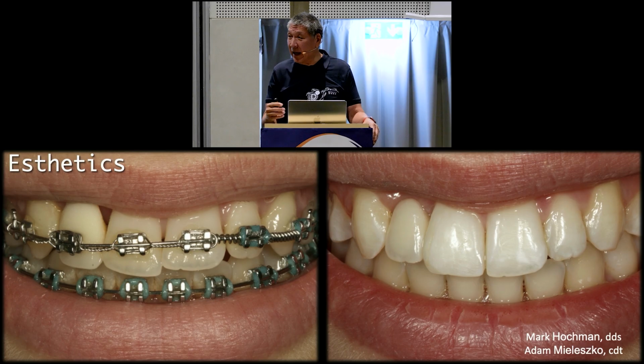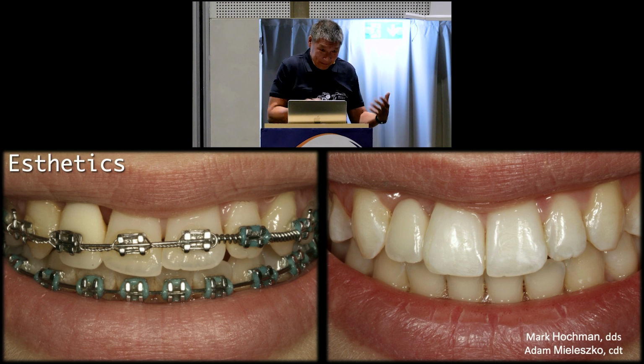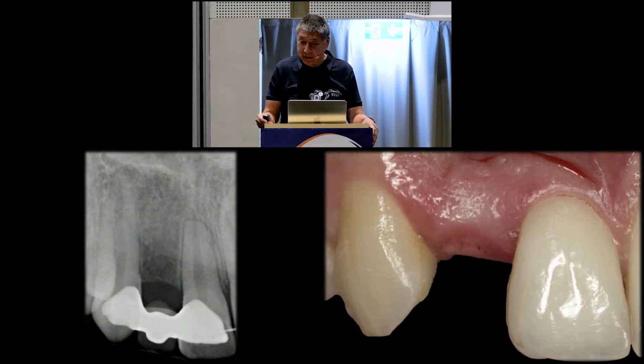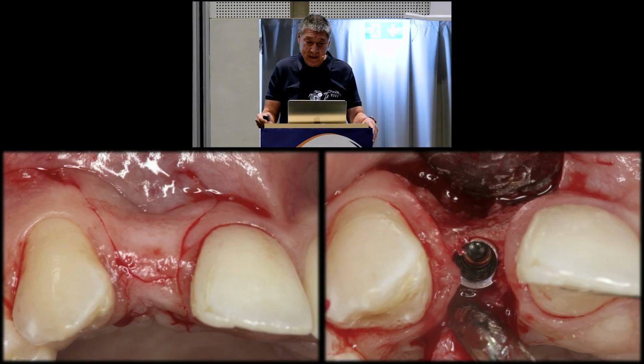Now, she only had one tooth that was congenitally missing. That was her chief complaint. But you could see that even for a single missing lateral, it was much more complicated than what she presented with. Understood? When she became an adult, we did see her, and Dennis was able to place an implant, as seen over here.